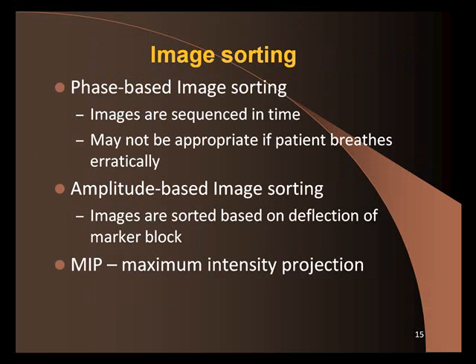So just so you guys know, breath-gated radiotherapy is not very commonly used across the board, because it's still controversial. And it's controversial because you do your CT scan and you acquire the 4D CT, but then you bring the patient to the treatment room and they breathe differently. So you've got this pattern that you've established in the 4D CT, but then they go to the treatment and the breathing is different.